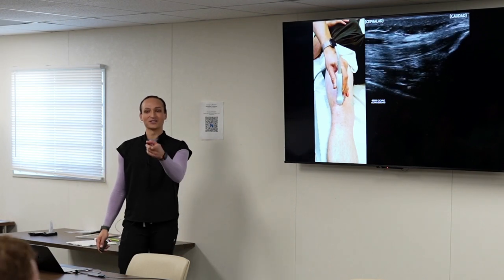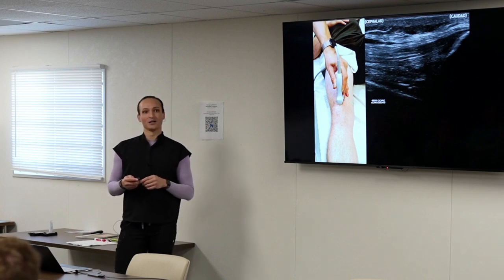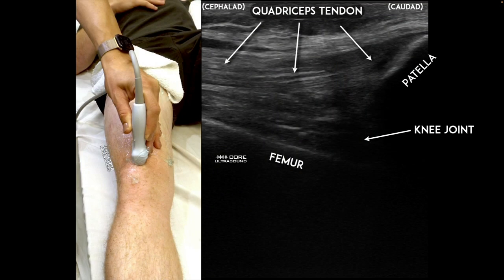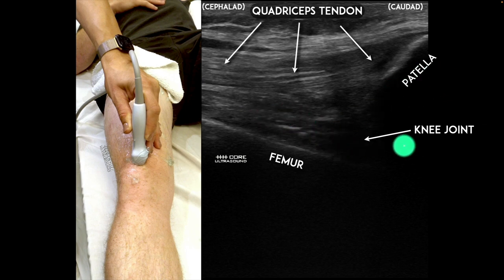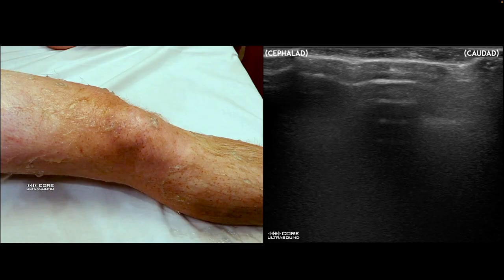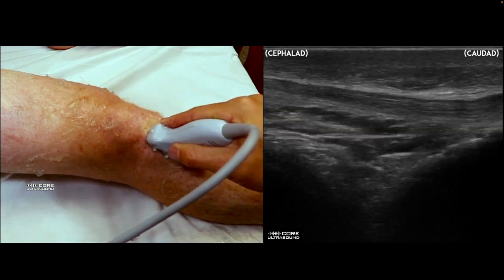Here's the anatomy with the probe marker facing up toward the patient's head, cephalad on the left side of the screen. The quad tendon is the most important landmark — anything deep to the quad tendon is a knee effusion, even if it's up here in the suprapatellar space. We have the patella, the femur, and the actual joint. You can also look inferiorly with the same probe orientation. This individual has a very strong patellar tendon — probably the best I've seen.